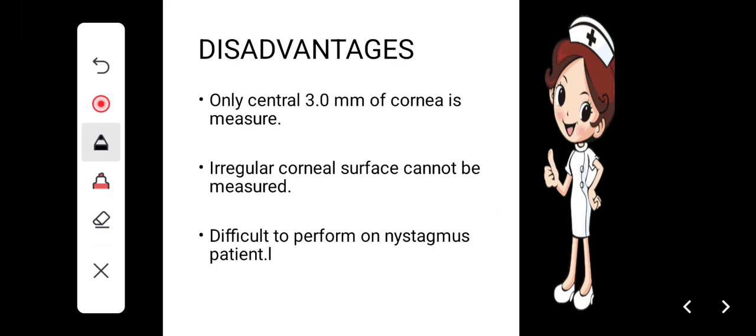It is difficult to perform on a nystagmus patient. If the patient has nystagmus and the cornea is continuously moving, then we are unable to perform this test on the nystagmus patient. This was the end.